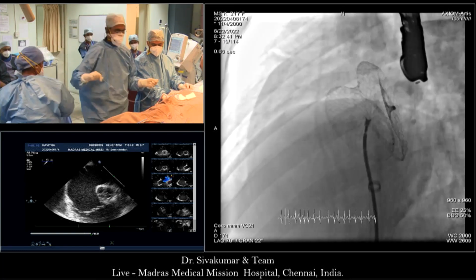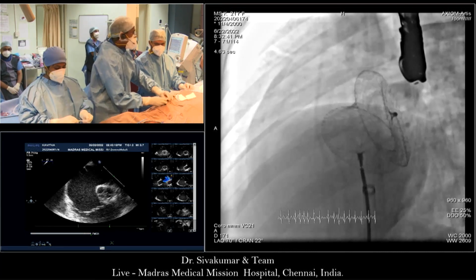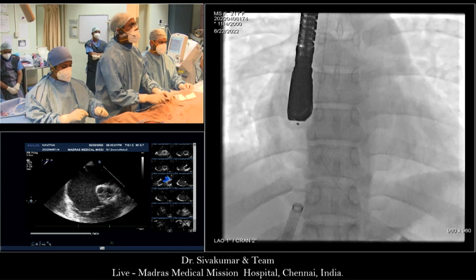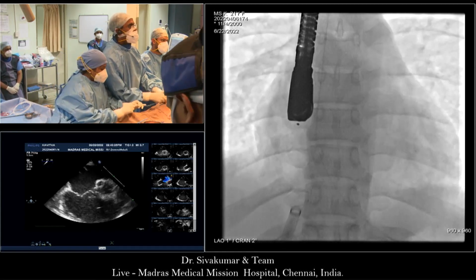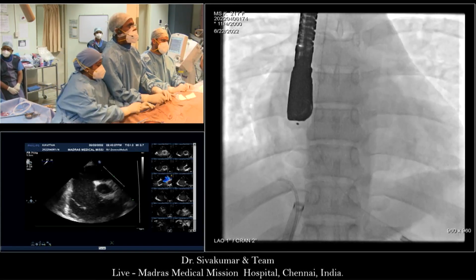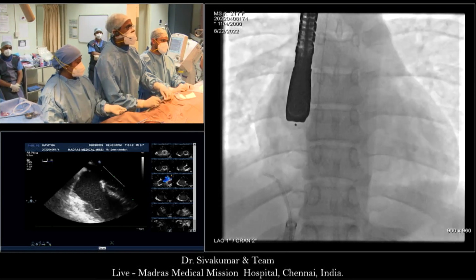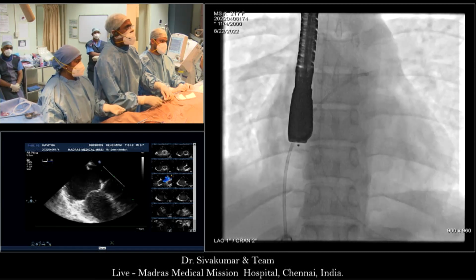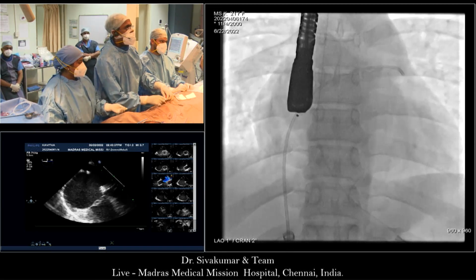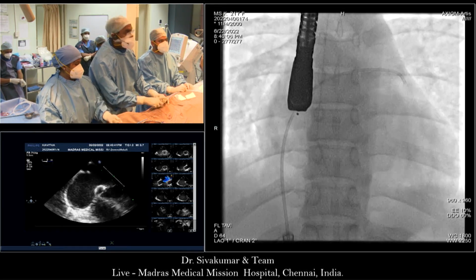We had the very good argument by him that small rims need a little bit more support, etc. We had Saeed's recommendation. We all know Saeed is Mr. Erosion, that's for sure. And so don't listen to him. But as he also said, his upsizing is fine, and we see that 40 millimeters is just, in my humble opinion, overdone. So I would go in between these 40 and the 32, which is 36.